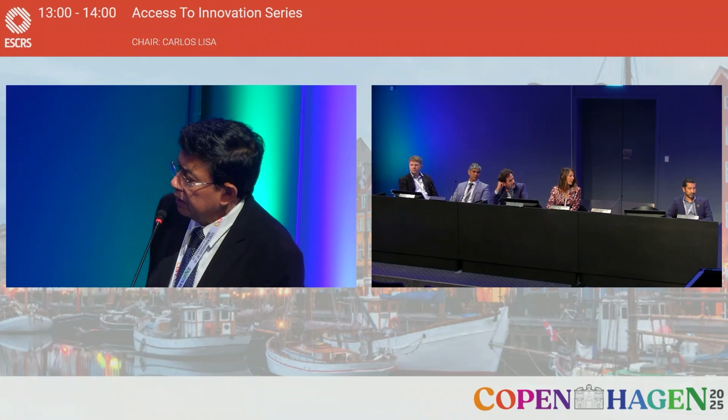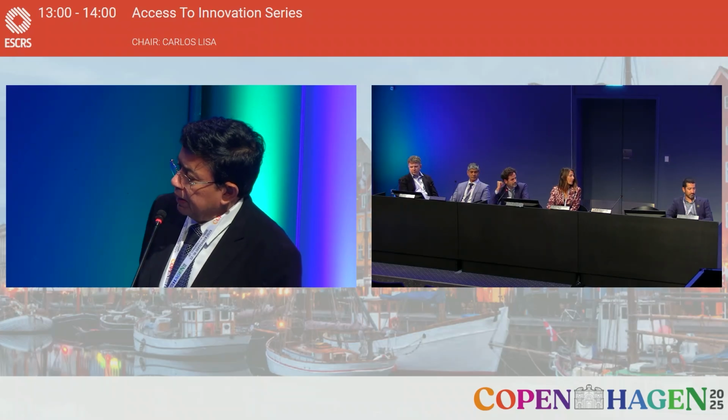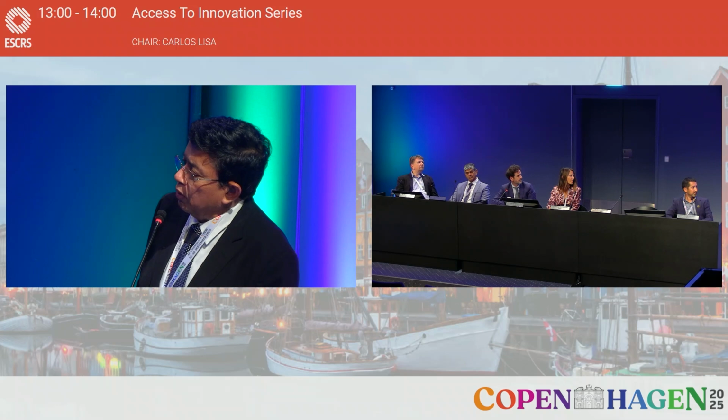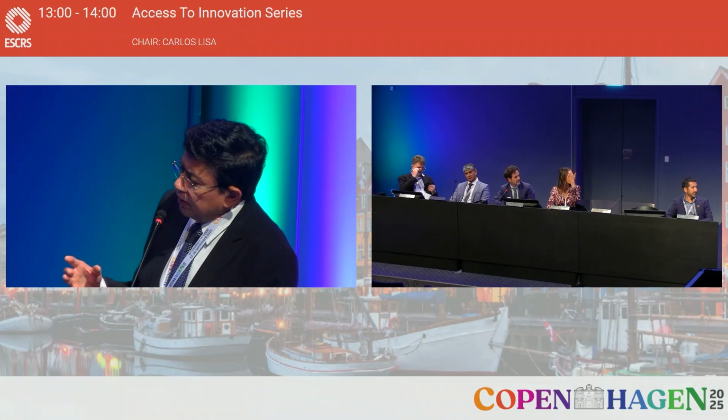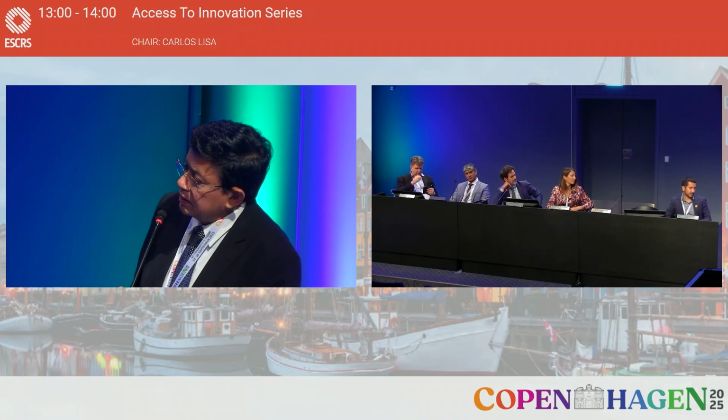Obviously, this is only 12 eyes I've implanted. But it's a general consensus about how I talk to my patients about full range of vision intraocular lenses and EDOF lenses. Essentially, when we talk about these lenses, it's a compromise either in the range of vision or in the quality of vision.